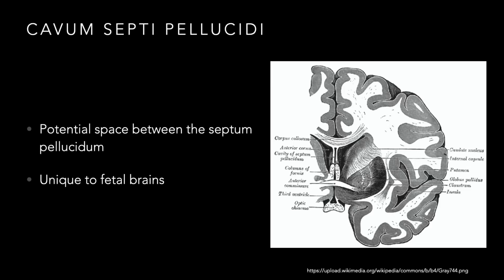And so you can see in that midline area in the image that the corpus callosum is the upper U-shaped connection, and the anterior commissure is the lower upside down U-shaped neural connections that cross midline. You can see the septum in the middle, and the very thin ones at the upper portion are the septum pellucidum.